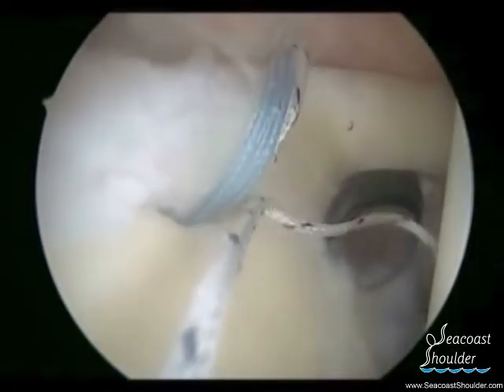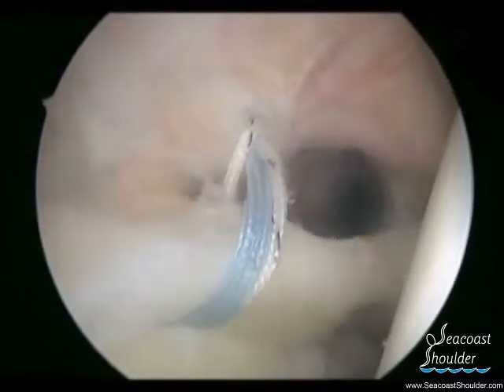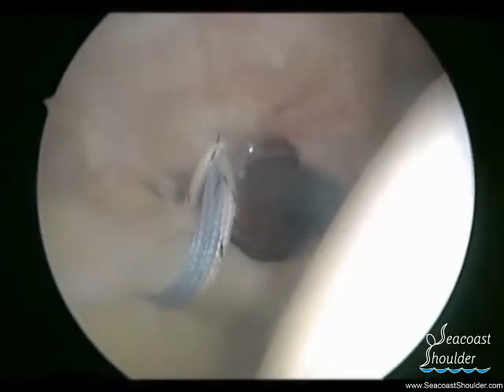Once the suture is brought through the labrum, the two black and white sutures can be grasped and tied, which will secure the labrum back down onto the glenoid.